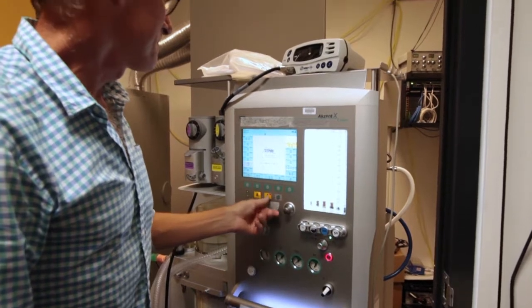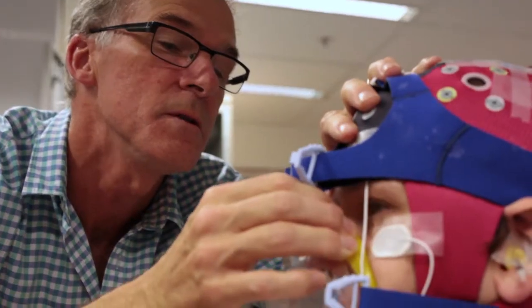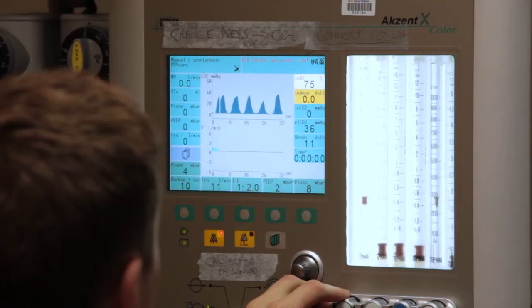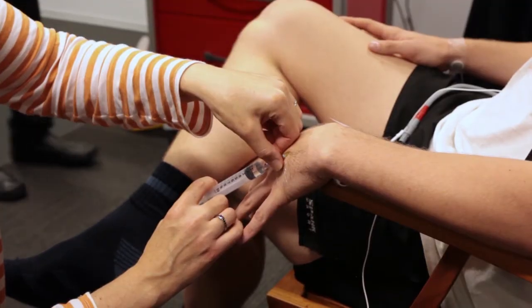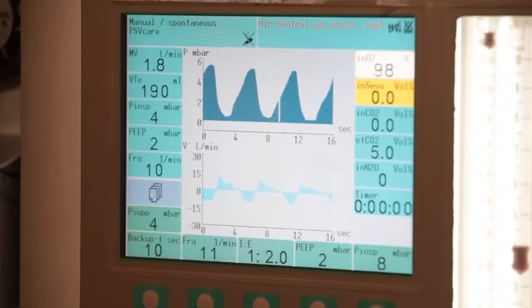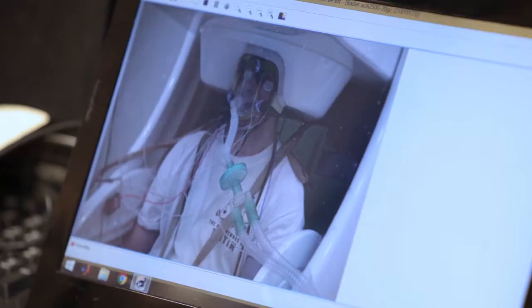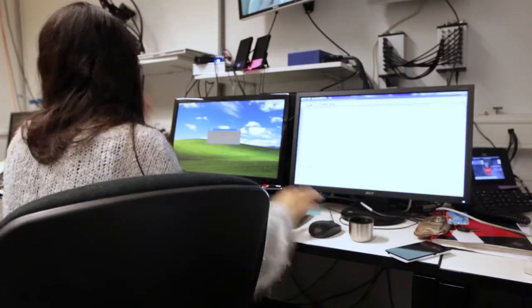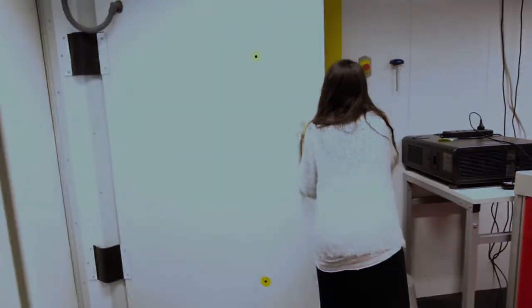The physician anesthesiologist will test the anesthesia machine, check that the mask fits comfortably and does not leak, adjust gas flows, insert a cannula, administer antiemetics, as well as commencing denitrogenation with 100% oxygen with the participants seated in the MSR before the final post-antiemetic baseline data collection and the start of the gas administration protocol.